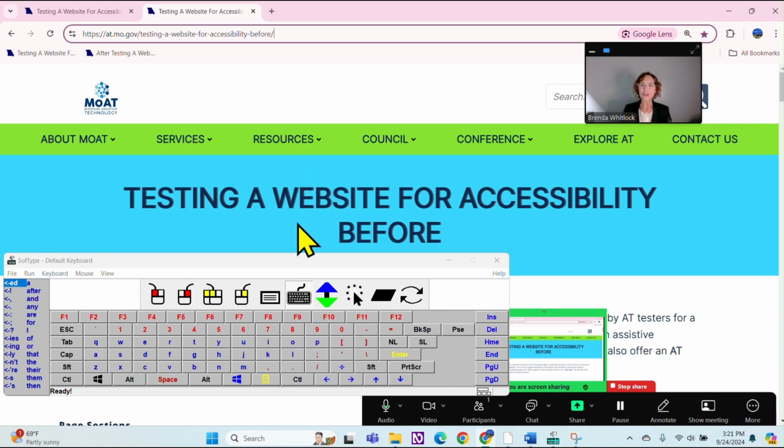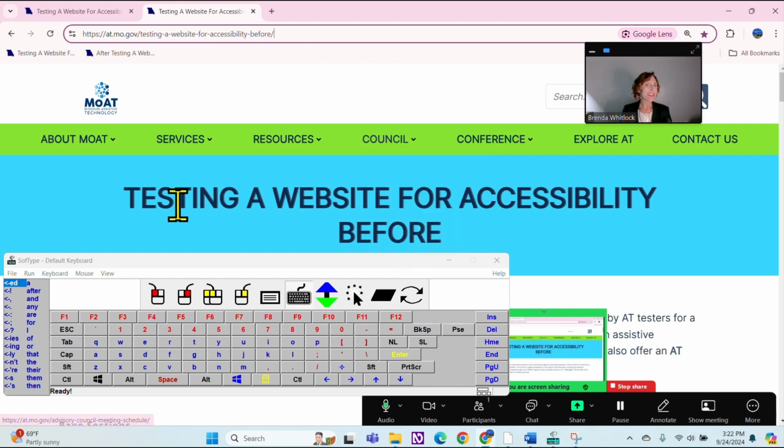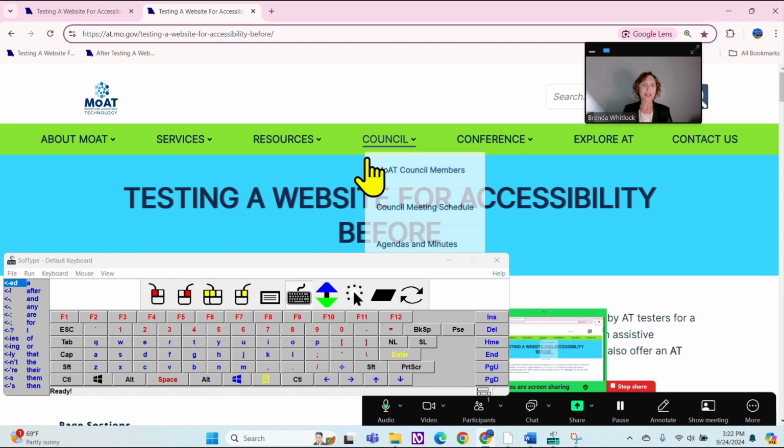So this is just a mouse alternative to the keyboard, and it is communicating through the IR tracking sensors with the head mouse. And as you can see, I kind of changed my cursor to the bright yellow so that you could see that today. And if I cover the silver dot on these glasses, you'll see that no matter when I move, that cursor does not move. And the light on the head mouse also turns red. But now that it's back able to communicate with the head mouse, we can move our head, and that is what's moving the cursor all around the page.